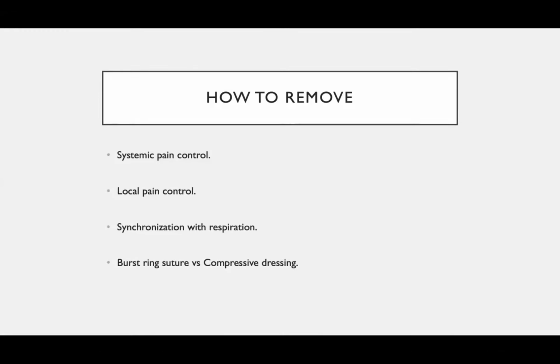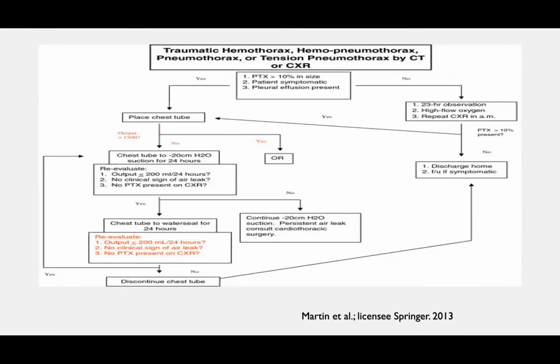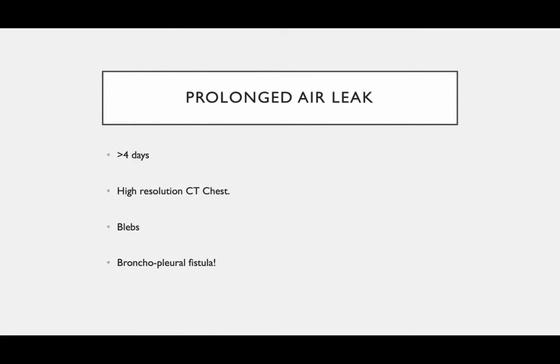that patient, if you are not keeping the patient under control, monitoring, okay, and the tube, and you haven't instructed him that if he develops any symptoms and signs of tension pneumothorax, the patient might die just like this on his bed. Okay, nobody will know about it. But if you have a good system and good monitoring and nurses that are taking care of their patient and you are around, okay, we can clamp the chest tube. This is my only problem with the clamping of chest tube. I will pass this because we are going to discuss more in the MCQs and in the discussion.